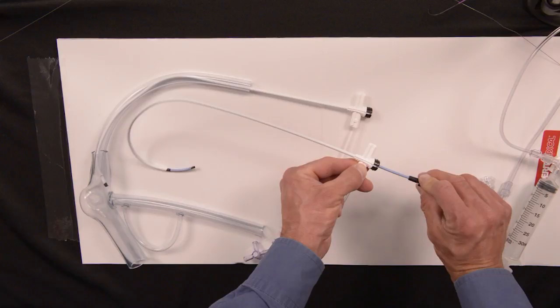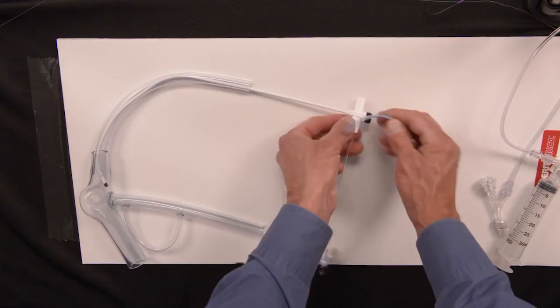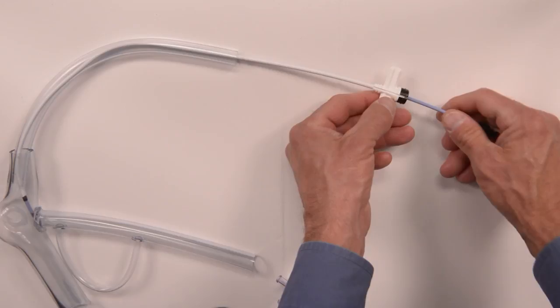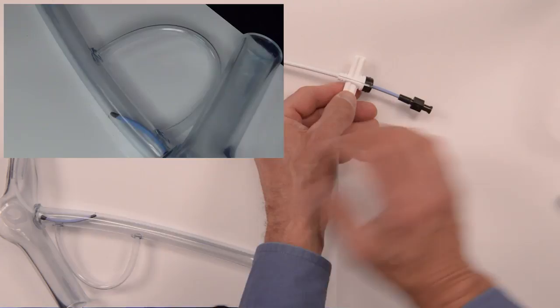I currently have a coronary sinus guide in our model into the right atrium. I'm going to insert that braided core, and with this model I'm going to show how this cannulates. I'm going to pull this back, insert the coronary sinus guide, and then use some push-pull technique to cannulate. Anatomically it would be a posterior structure.